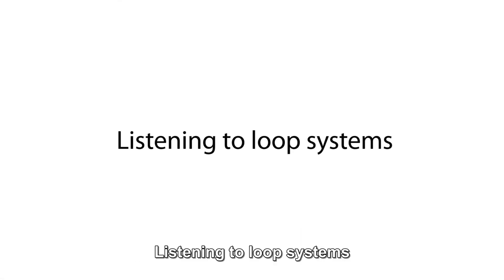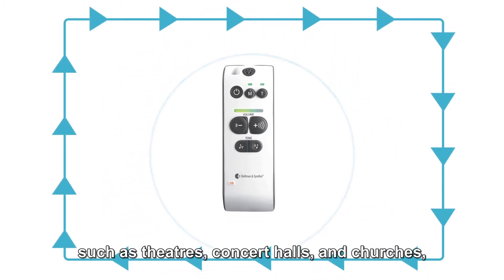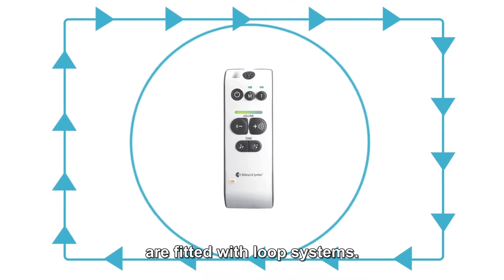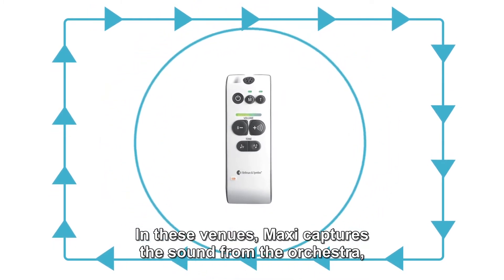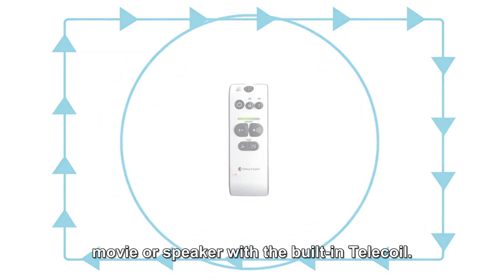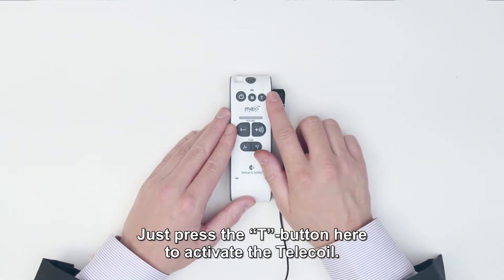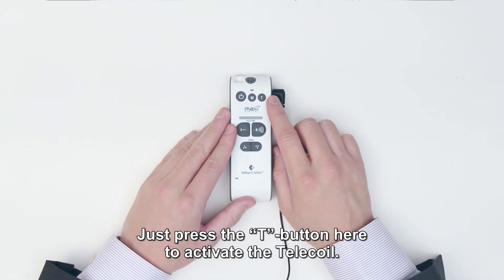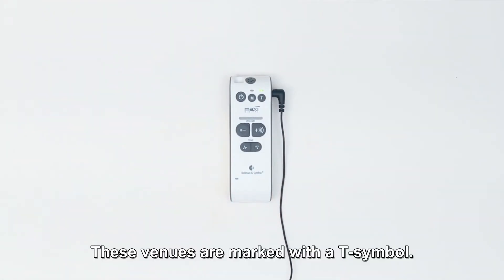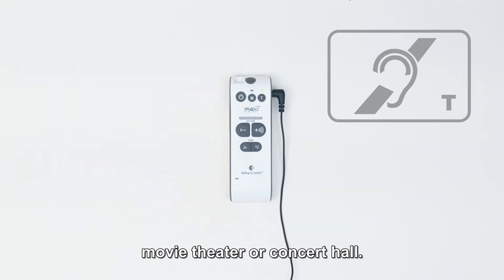Listening to loop systems. Many public venues, such as theatres, concert halls and churches, are fitted with loop systems. In these venues, Maxi captures the sound from the orchestra, movie or speaker with the built-in tele-coil. Just press the T button here to activate the tele-coil. These venues are marked with a T symbol — look for a sign with a T symbol next time you visit your favourite movie theatre or concert hall.